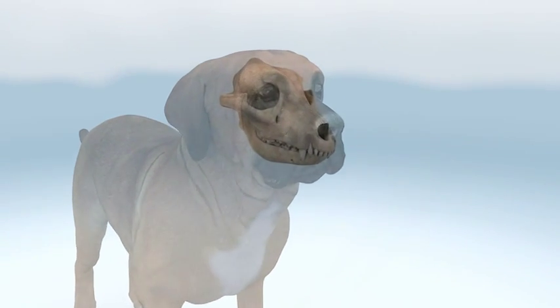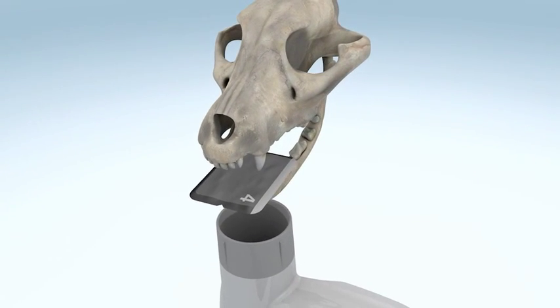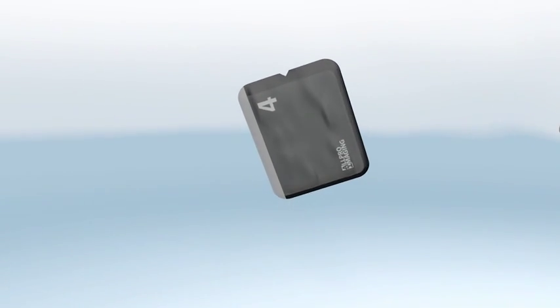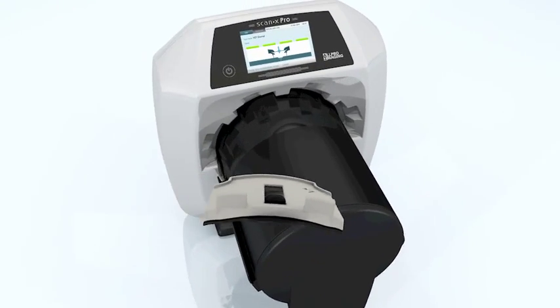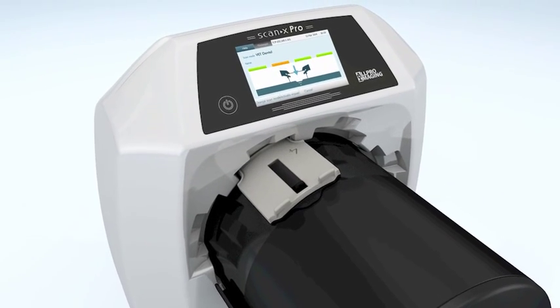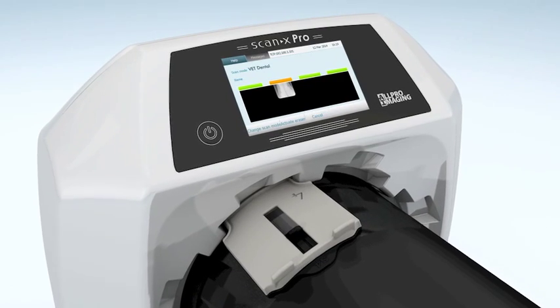Varying sizes and flexibility of the imaging plates allow for easier positioning as compared to intraoral sensors. After an exposure is taken, the imaging plate is removed from the light barrier envelope and fed into the scanner through the associated plate guide. The intraoral image quality outperforms any other modality by far in terms of resolution and diagnostic information.